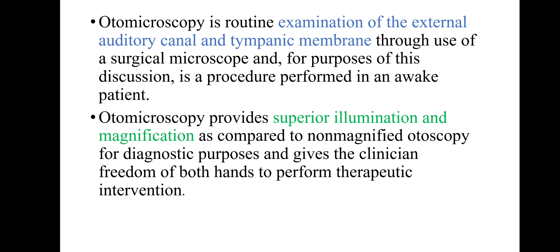Otomicroscopy is a routine examination of the external auditory canal and tympanic membrane through use of a surgical microscope, and for purposes of this discussion is a procedure performed in an awake patient. Otomicroscopy provides superior illumination and magnification as compared to non-magnified otoscopy for diagnostic purposes, and gives the clinician freedom of both hands to perform therapeutic intervention.